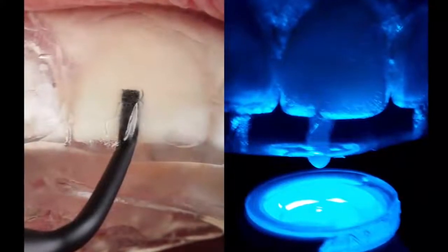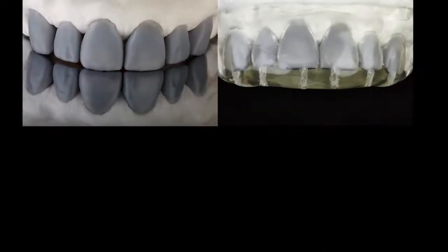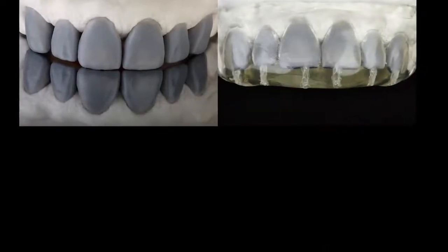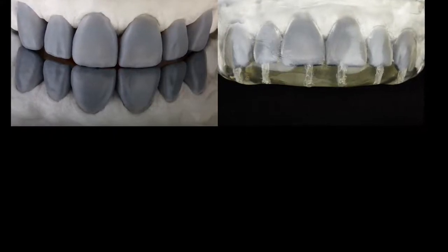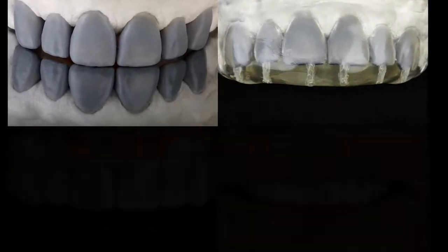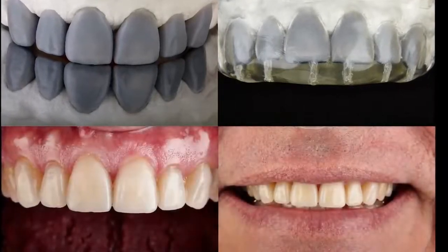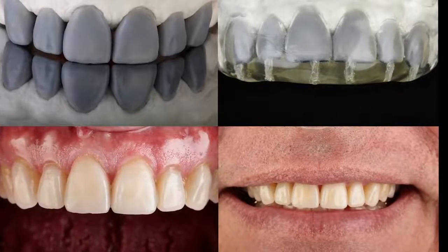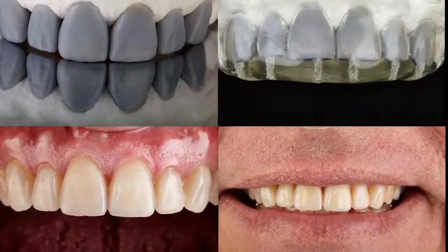This clear vinyl polysiloxane material, Exaclear by GC, allows you to visualize the injection process with a flowable material such as G-ænial Universal Flo. You can eliminate any voids by compressing the matrix from the facial or buccal and lingual, and you can see the orientation of colors of the flowable before light curing.